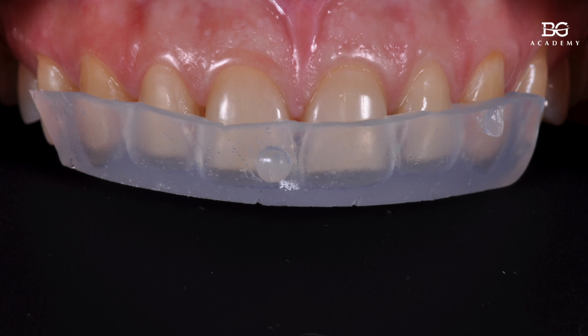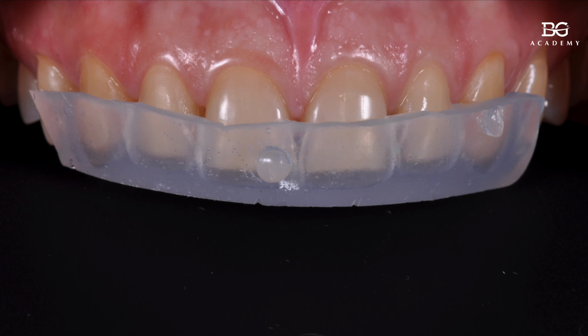I find it very useful for some cases, but again, you will need to try it to make your own opinion about that technique. The technique is called half matrix, and it can be made in two ways. You can use transparent silicone for that, like you can see on the screen, or you can use your conventional PVS or C-silicone like you do on a regular basis, but you cut the silicone index up to the interdental papillas.